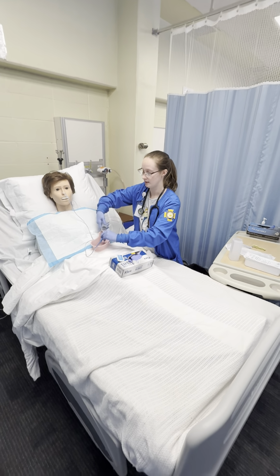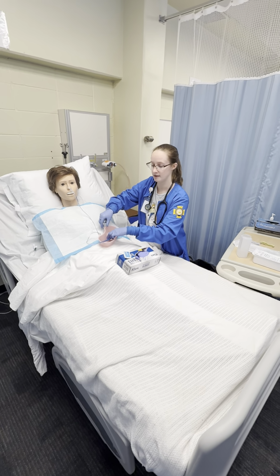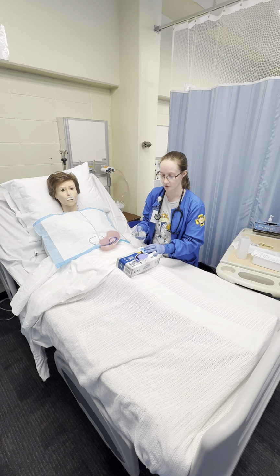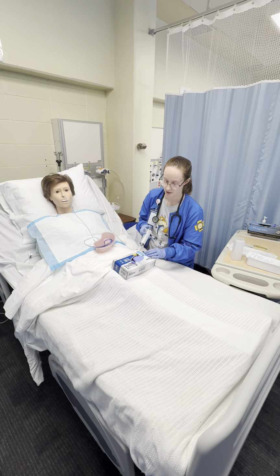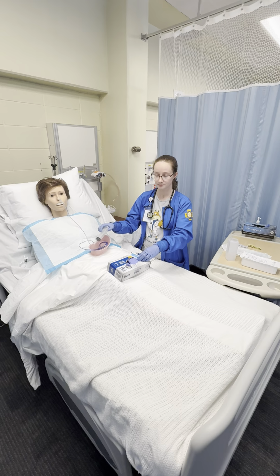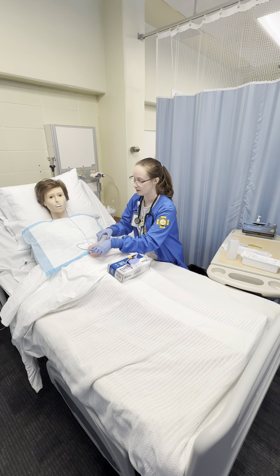So I'll go ahead and remove this and cap my tube back, and then I'm going to go over here to my pH strip, and I'm going to put the stomach contents onto the pH strip. And we're looking for anything 5.5 or less. So it is within range, so we are good.